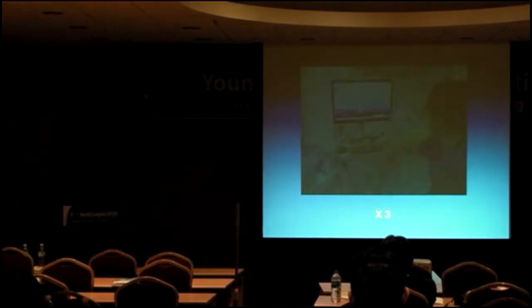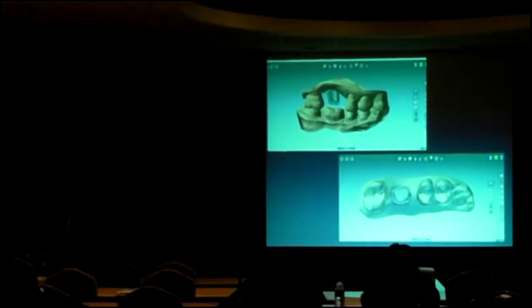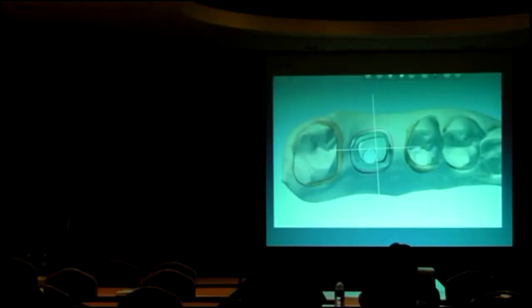And also, for implant cases, you don't need to worry too much about the margin. Detection is not critical. So after that, I used the data and designed the abutment. When you see this, I told you that I placed the implant too palatally and too distally. So this is how the emergence profile comes. I extended to the other side a little bit, but I was considering the tissue response. I don't want to put too much.